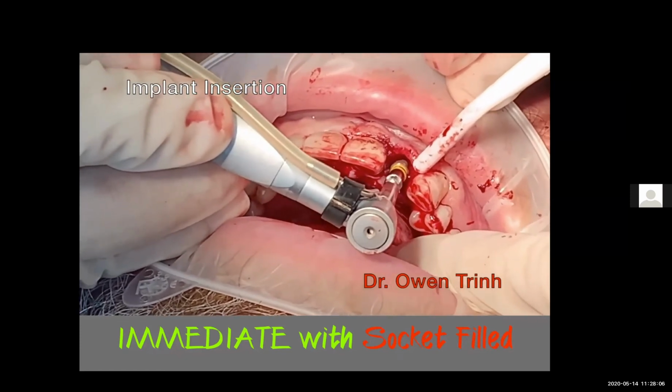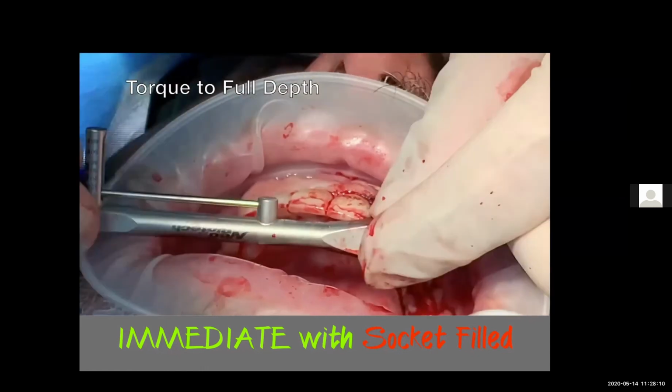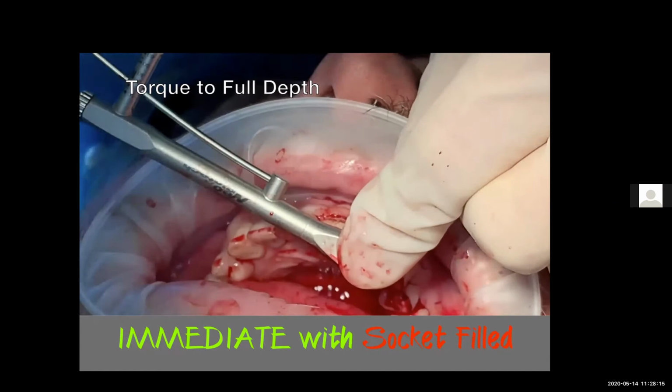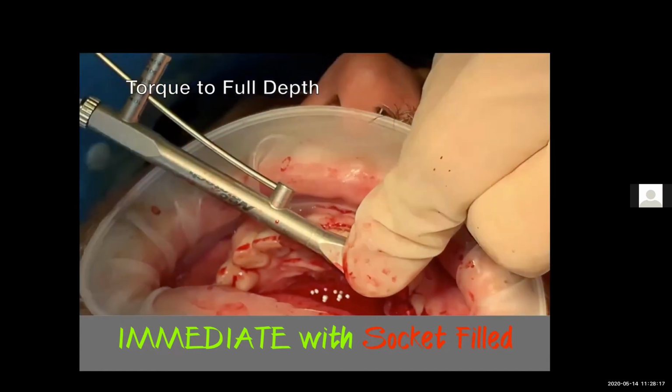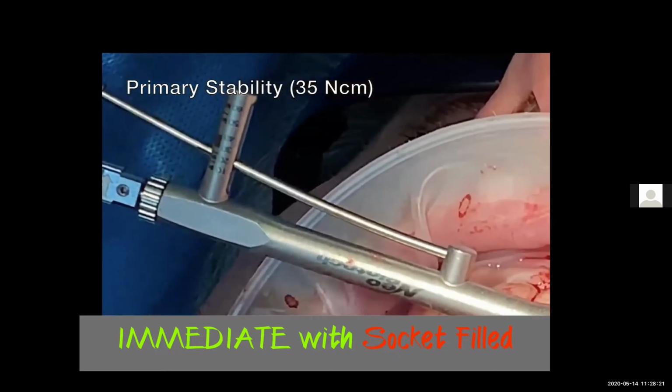And now the implant is being placed, and you see the counter-resisting force from the palatal wall trying to kick the implant toward the facial. So it's really important that we keep our hand and implant handpiece steady. So here we have primary stability above even 30 Newton centimeters.